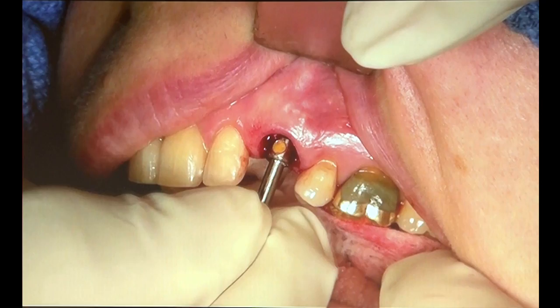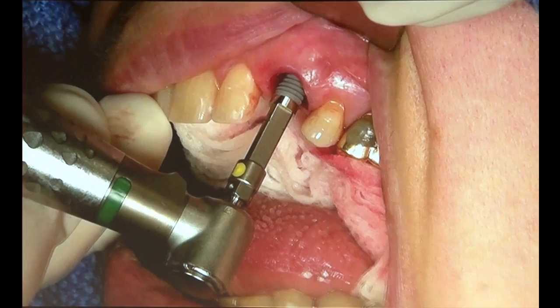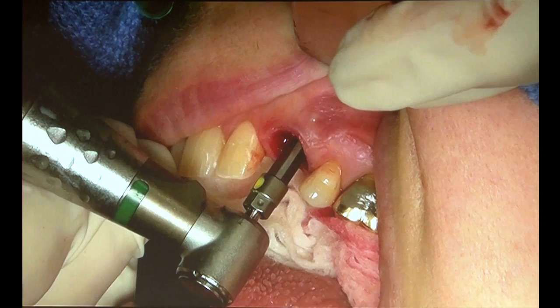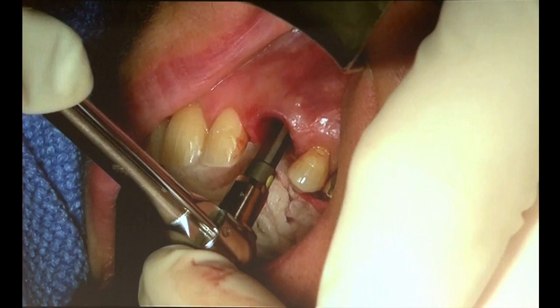So once I'm done augmenting, I'll remove the twist drill and place the implant in directly. This also helps to avoid compacting the graft material into the inner aspects of the implant. Again, I typically insert this at about 35 Newton centimeters, and I'll let the handpiece come to a full stop on its own right there before finalizing the seating or the positioning of that implant. I like to seat the implant no more than 3 millimeters below the margin of the gingival tissue.